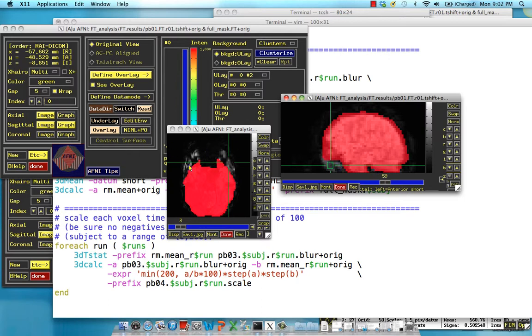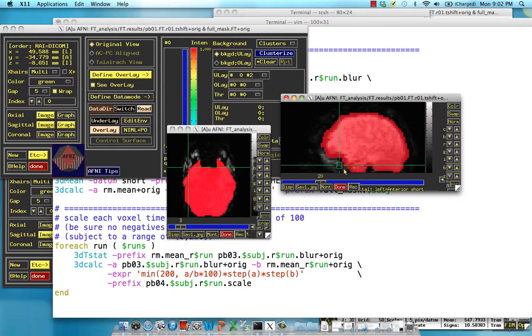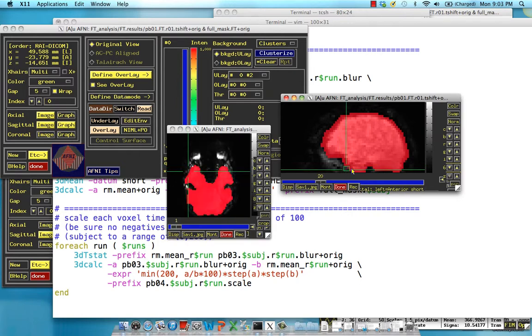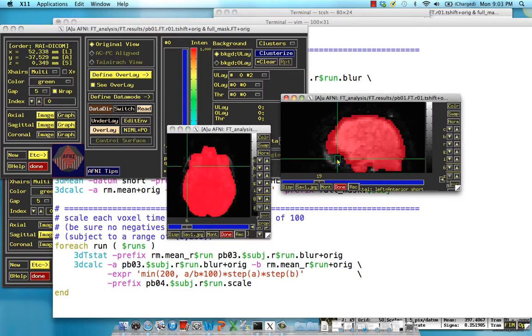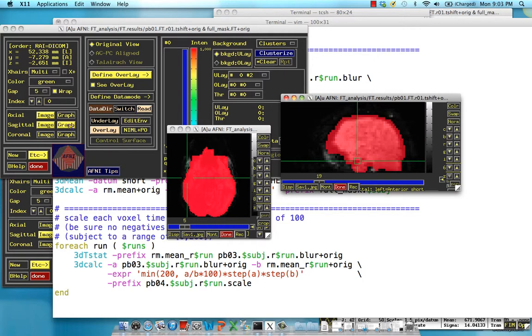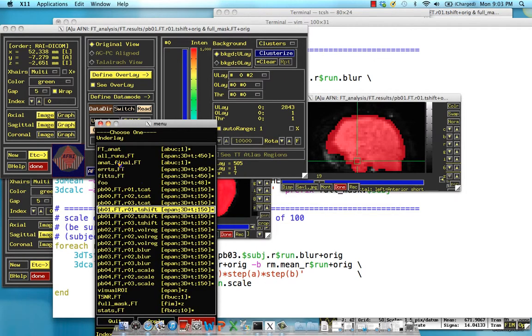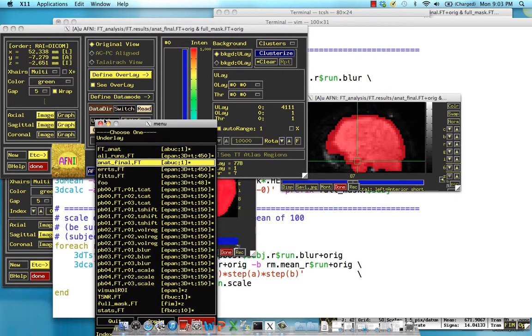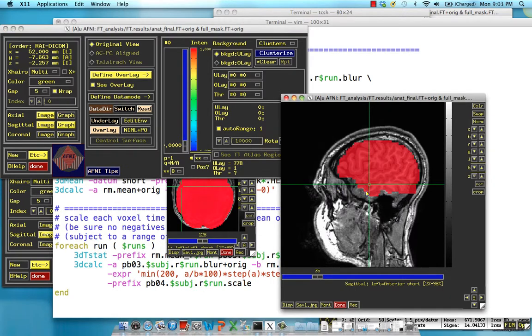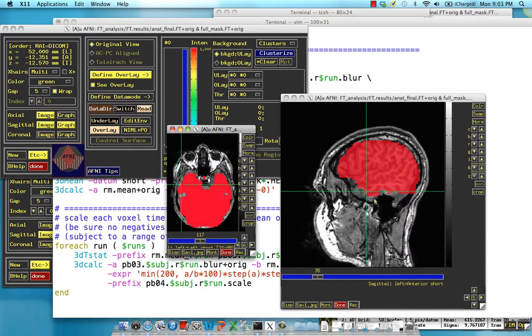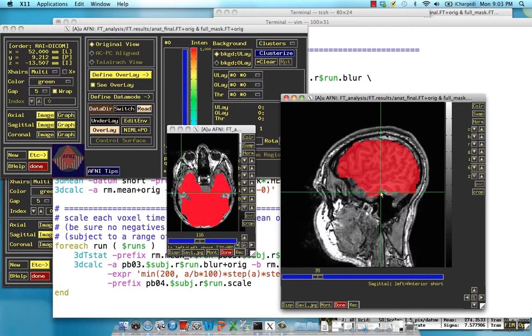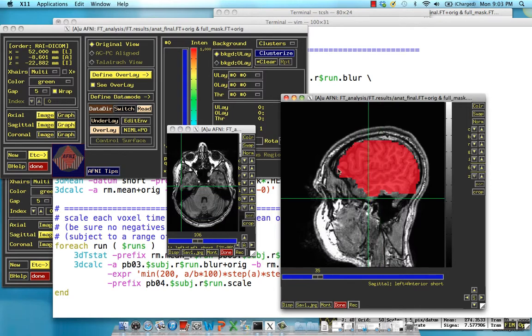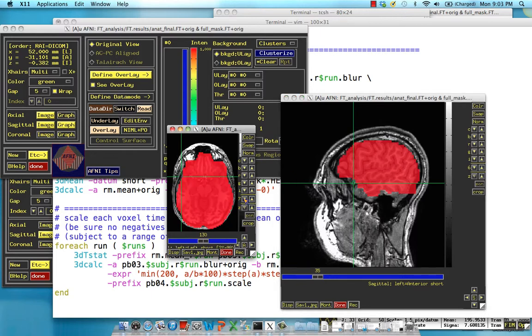And in places where the signal intensity drops out a lot, this is actually relatively good. Actually that appeared to be skull. So it actually did very well. Let's go to check that. And also as an underlay, have your anatomical and look at that as well. That's actually more important. So you can see that there's some places in the temporal lobes near the cavities where there's enough signal dropout to make 3D AutoMask think that there's no real brain there.